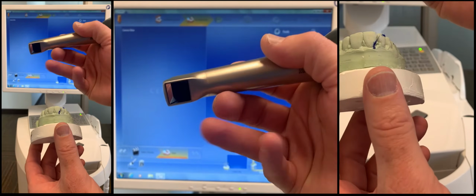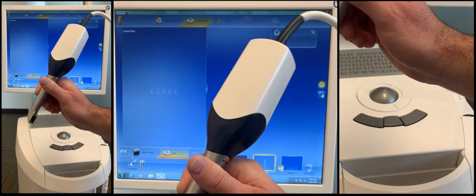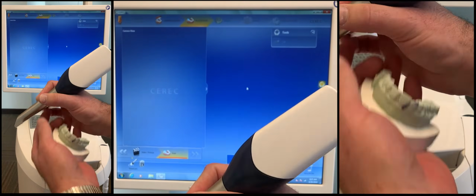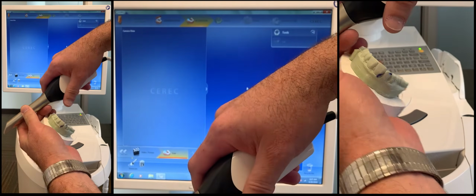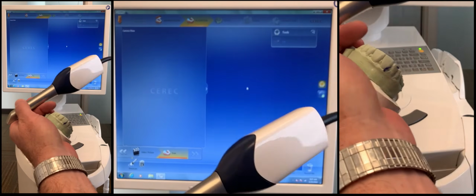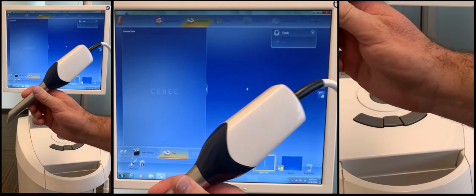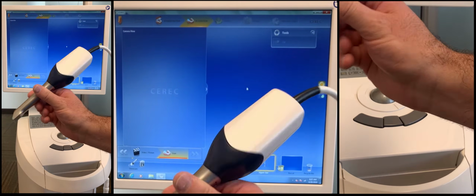When we go in, I always have a fulcrum. I'd suggest you always hold the camera like a handpiece or a pencil. Some of the less experienced docs will hold it overhanded, and you can certainly do this temporarily if you need to. It's just so much easier and balances a little better, even though it's pretty bulky on the back end, if you hold it in this manner.